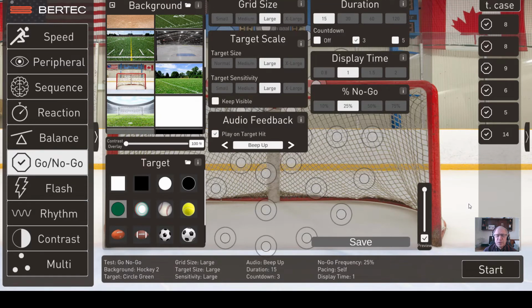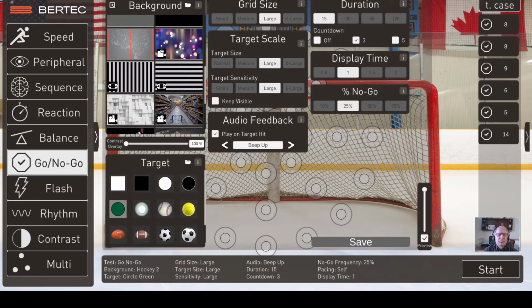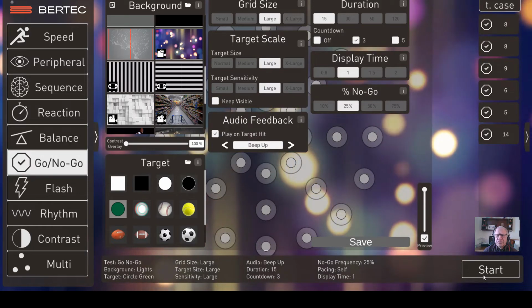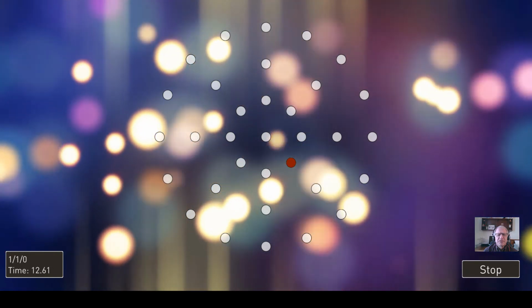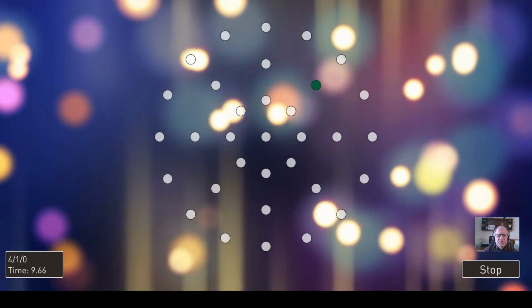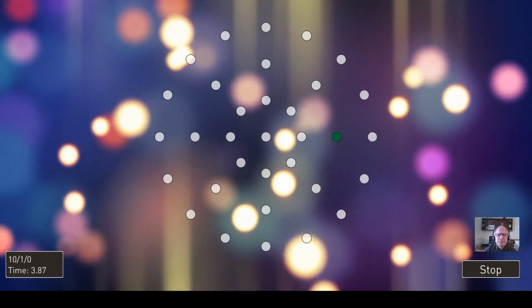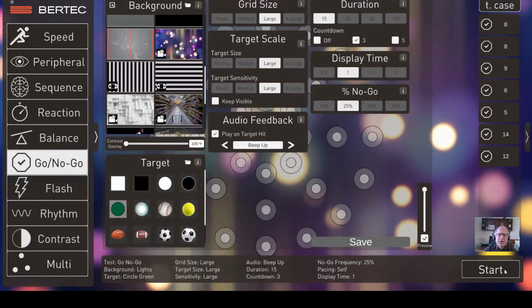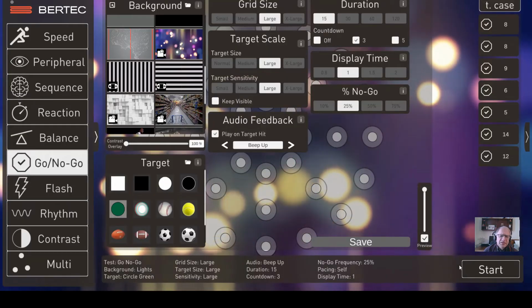If we really want to make it more challenging, particularly when they're close to return to life kinds of skills, we'll use a motion background. And obviously, the more confusing the motion, the more difficult the task. This happens to be a background that proves to be difficult with this task because we have, in a sense, circles that are popping up, changing colors, and very, very distracting. But we can be very sports specific if we want. We can make the demand as challenging as they can stand, basically.